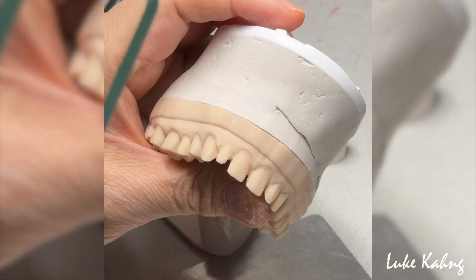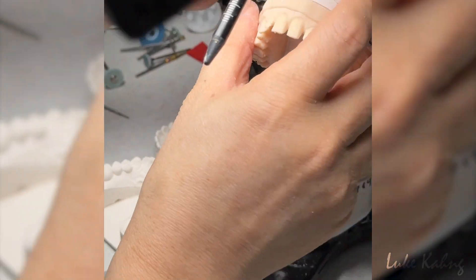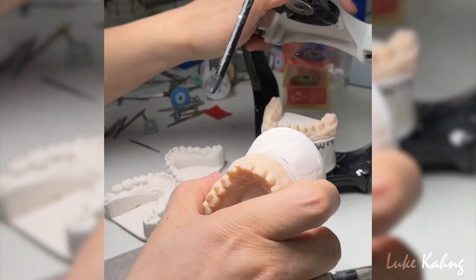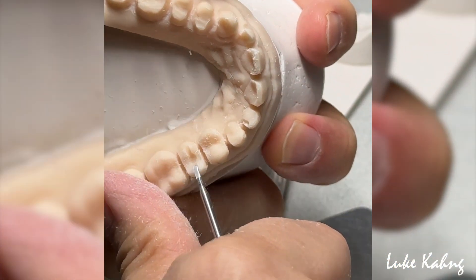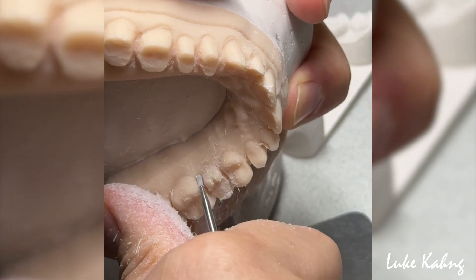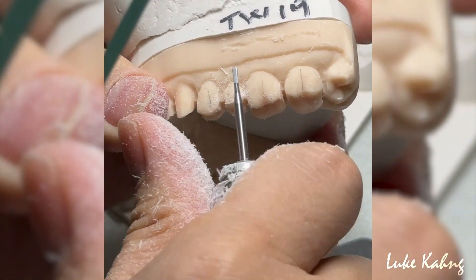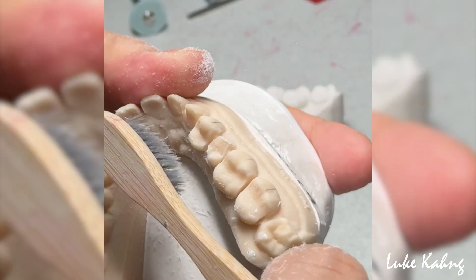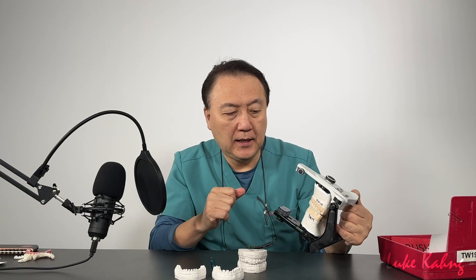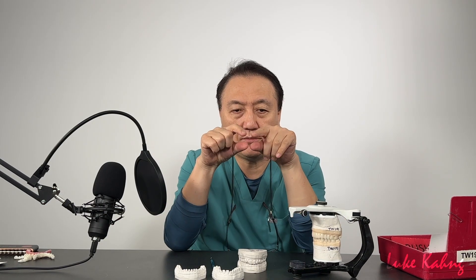Canine to canine — that's good. The lower prep is already done, now I prep the upper one by one. I need a two-millimeter reduction. I set up the lower anteriors and then the curve of Spee and Wilson. The lower jaw is always moving, so I can set up the lower teeth alignment — Wilson curve and curve of Spee.